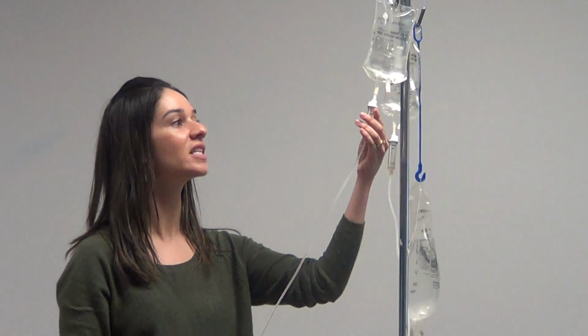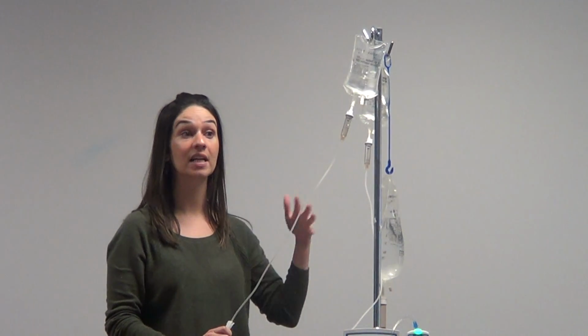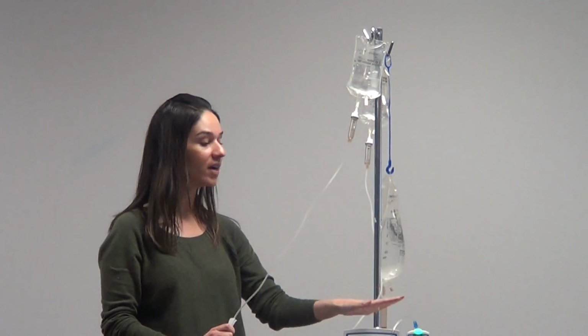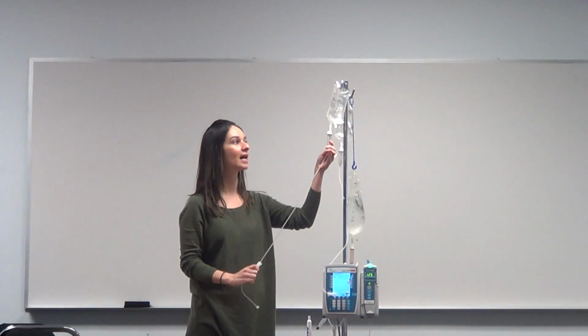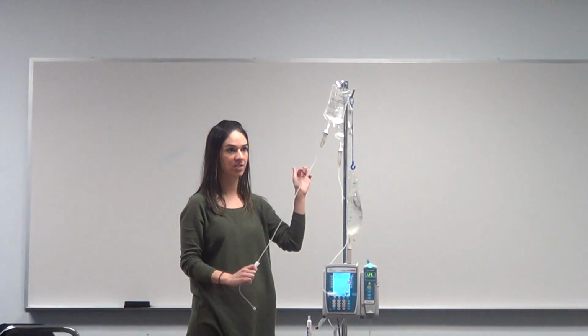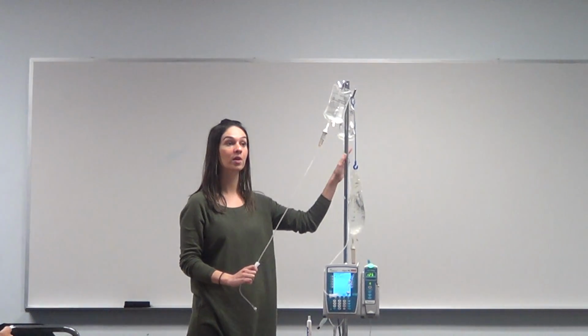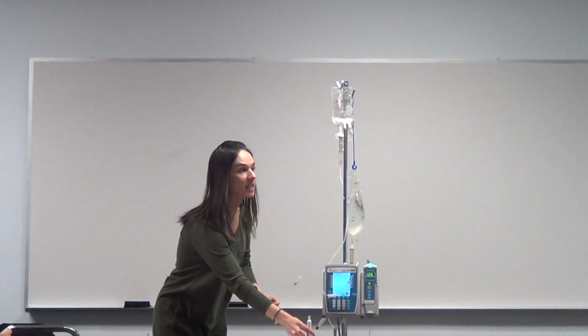So a lot of times you'll see by gravity in the OR, a lot of times in PACU, they're hanging things by gravity, antibiotics, things like that. But for safety reasons, for instance, your critical care drips will always be on a pump. Because isn't a pump much more accurate than us kind of dialing this thing up and down and counting how many drops per minute are in the chamber, right? Pumps are more efficient. So, either way, you need to know how to calculate the flow rates for both.